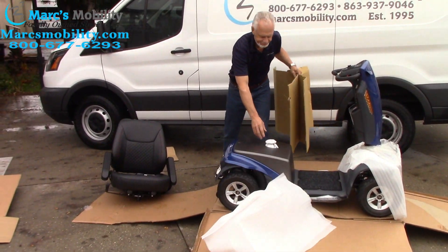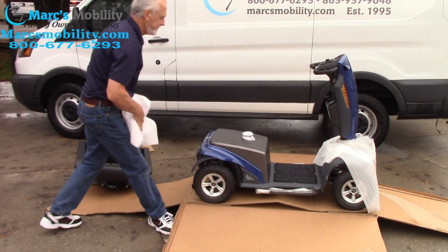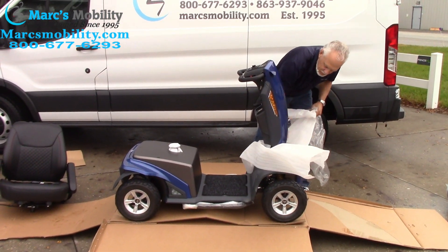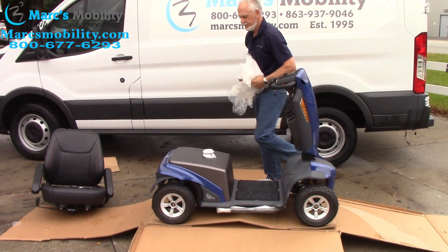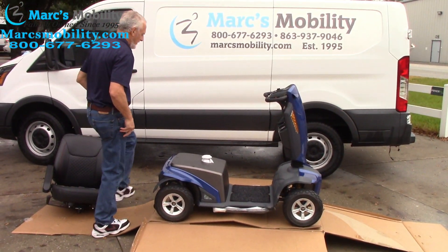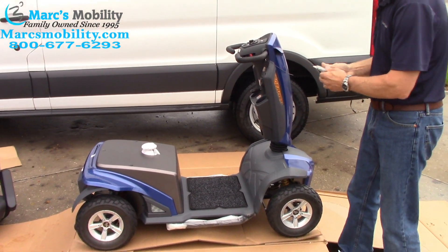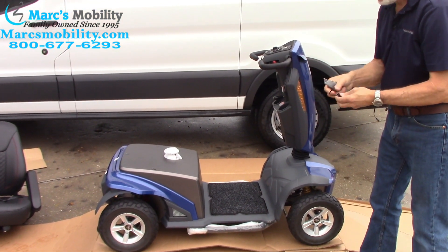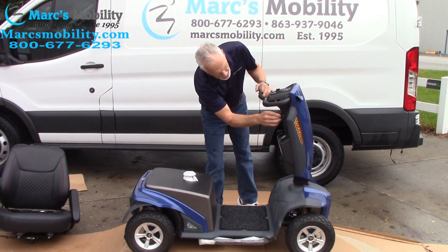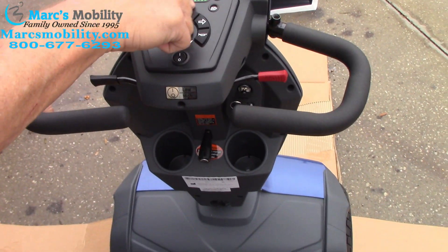I'm going to take the rest of the boxes and plastic out. So now the keys are right here — I can see the keys right there. So I'll cut them off. You have two keys. I'm going to put them in just to see if the batteries are connected. The keys go right here. Turn the key on and the batteries are connected — I can see the light on the scooter right here.